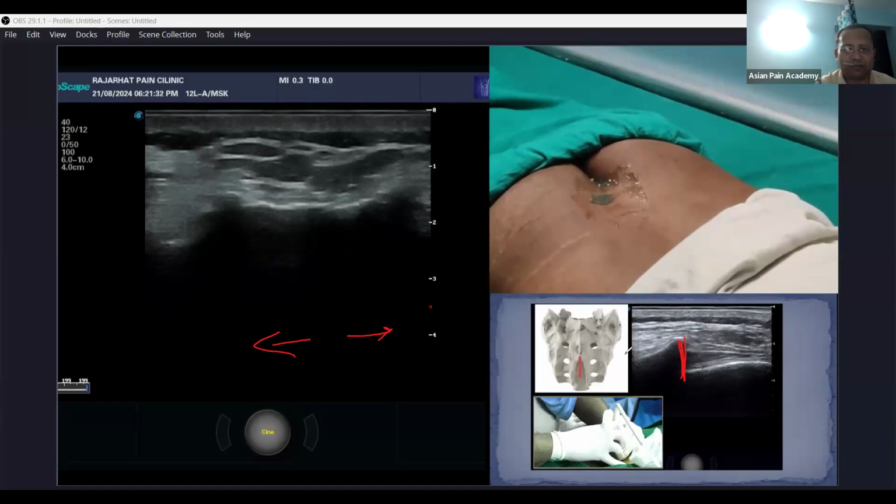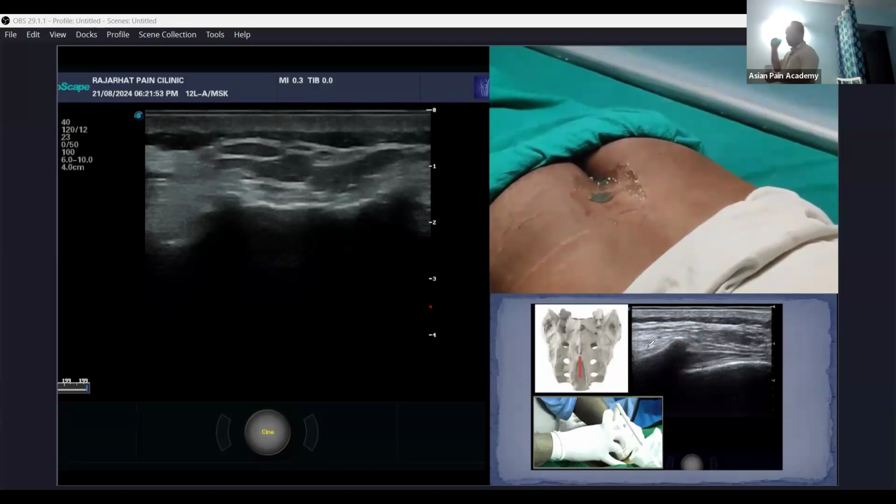And of course proximally you will see the spine, sacral spine, rudimentary spine, but still you will see the spine, and you will understand that you are in the midline. And that midline is necessary for the procedure, because you need more space also, and most of the time you are giving caudal epidural, so it should spread equally both sides also.